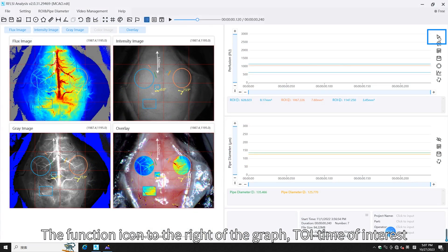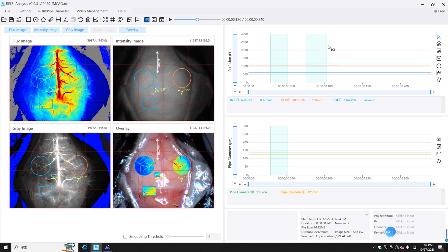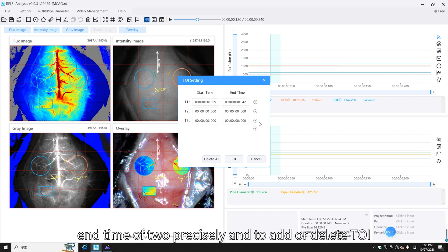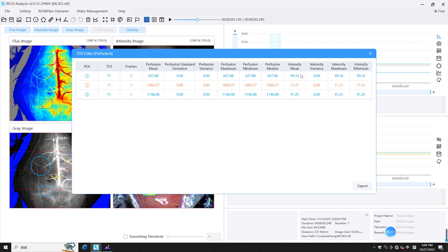The function icon to the right of the graph is TOI (Time of Interest). Click on it and hold down the left mouse button to select the time of interest in the graph. TOI Settings allows you to set the start and end time of TOIs precisely and to add or delete TOIs. TOI Data allows you to view data related to perfusion volume, and data can be exported.